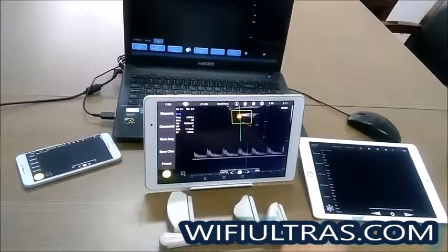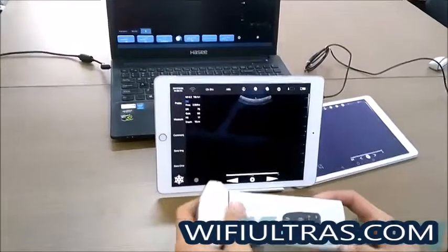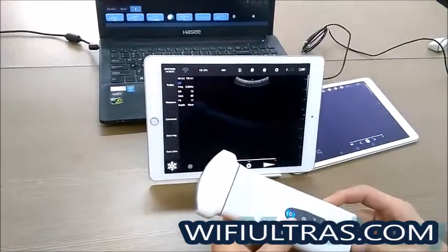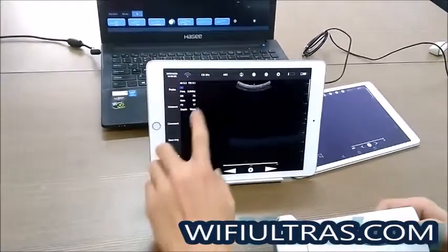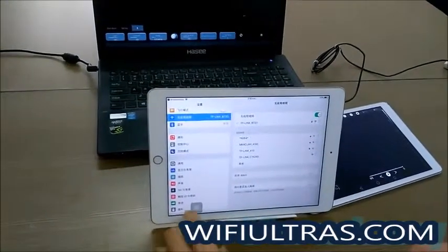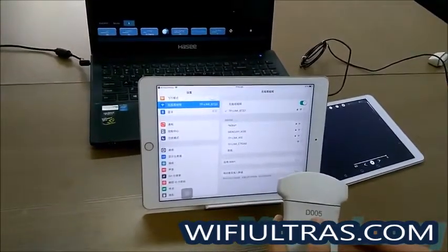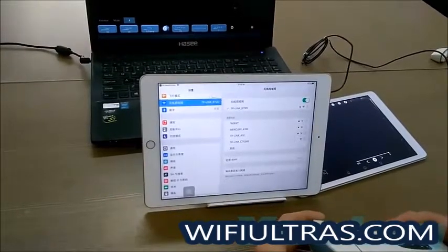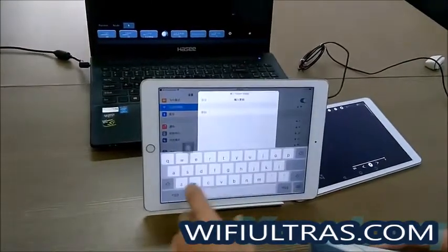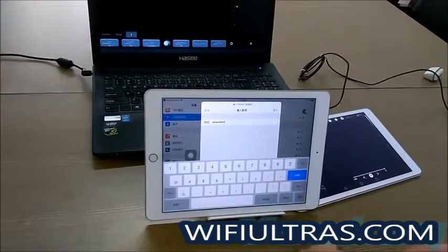Now I'll show you how to connect the iOS device. You need to disconnect the current device first, then make sure the machine is on. Run the software on iOS, click here, enter this section, connect this device name, and wait for detection. Then input the password.